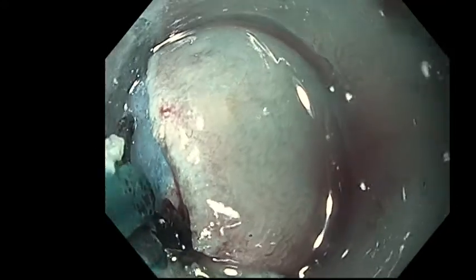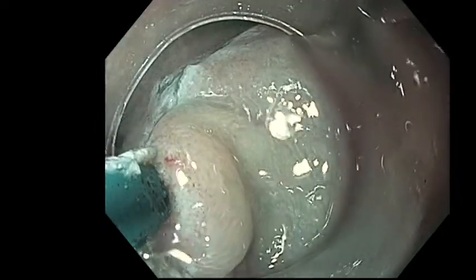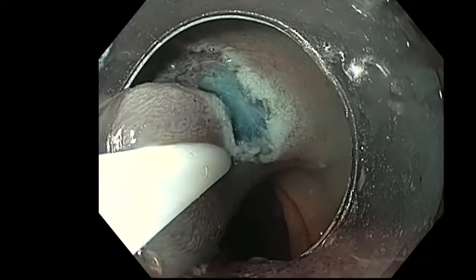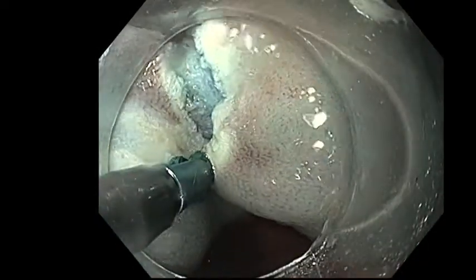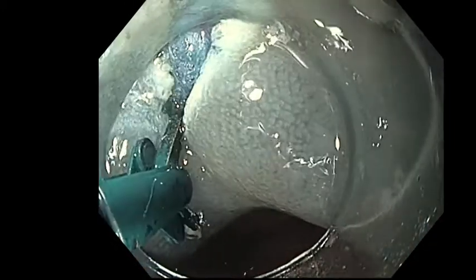When recognizing a rather thick vessel, use soft coagulation longer before a cut. To avoid perforation, we maximize attention to obtain a good and long-lasting elevation of the submucosal layer by injecting a lot of glycerol.